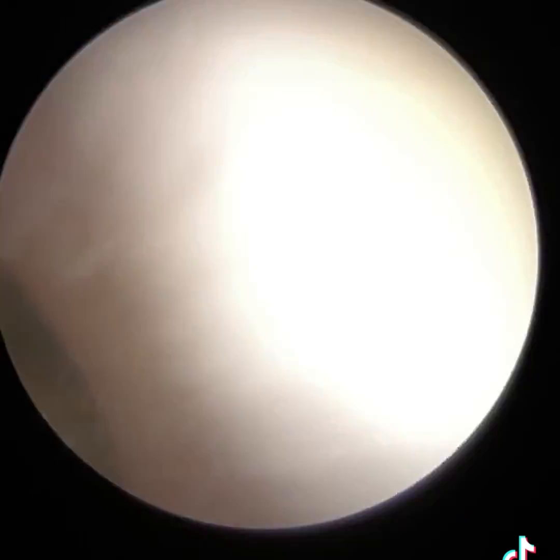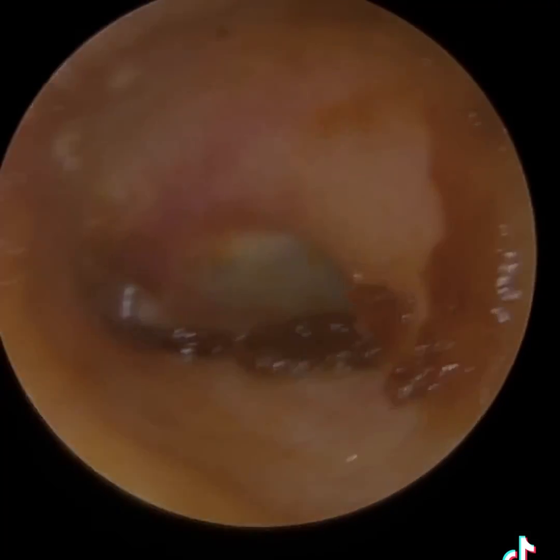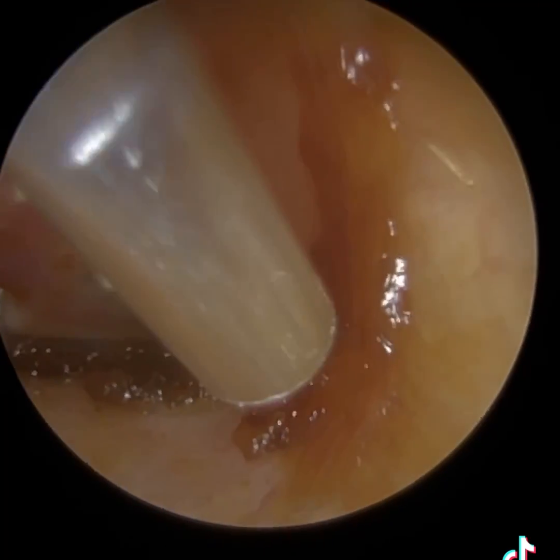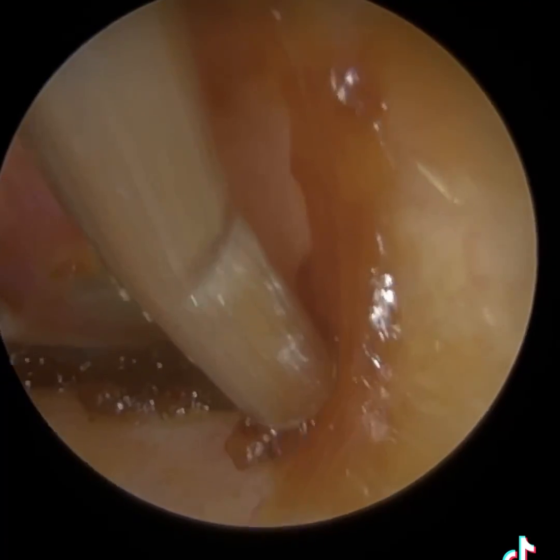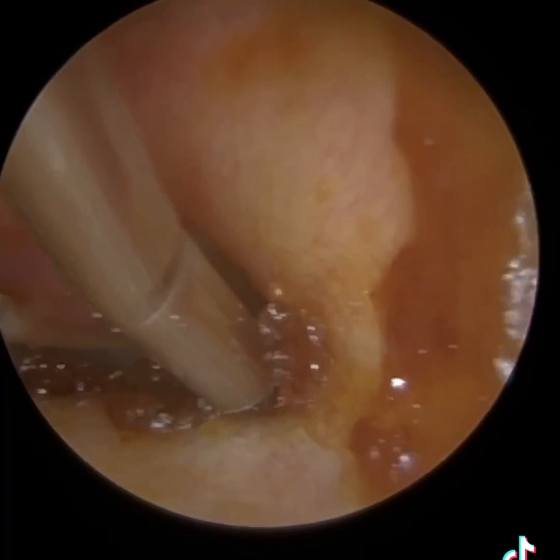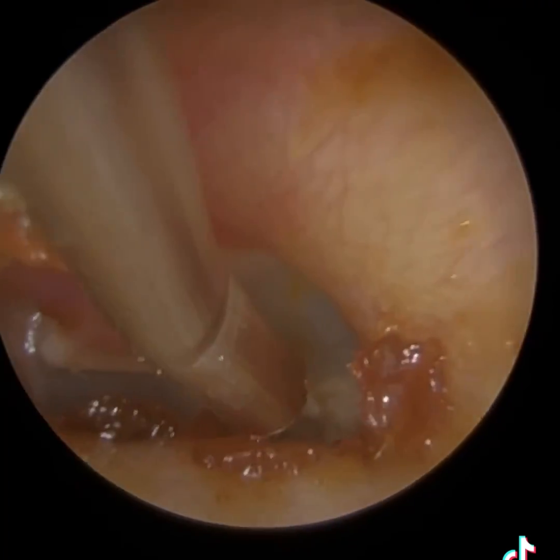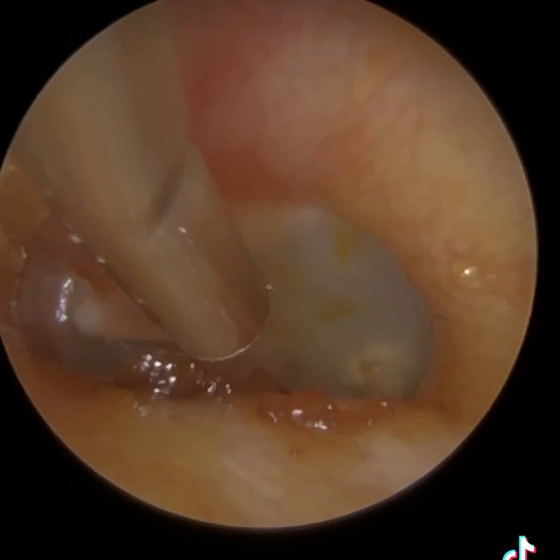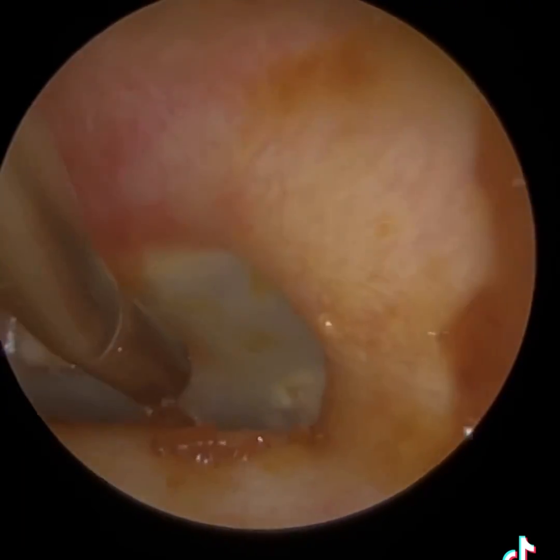The ear canal's completely clear now — we can see the eardrum. This is some residual soft, sticky wax that's just remained within the ear as I was removing it, so I'm just going to hover over this. We do have to be careful; it's like a game of Operation, actually. We've just got to make sure we don't touch the bony part of the ear canal, because if we do it'll be very, very uncomfortable for the patient, as it's a very sensitive region — the bony part of the ear canal, which is the inner two-thirds.